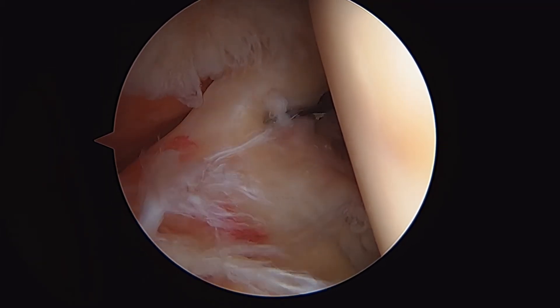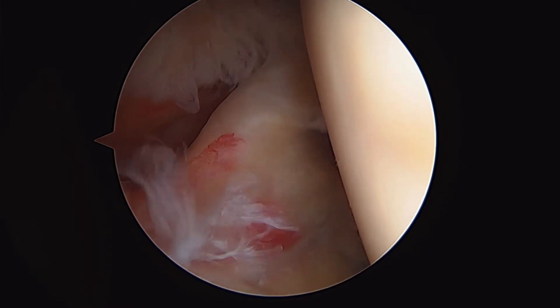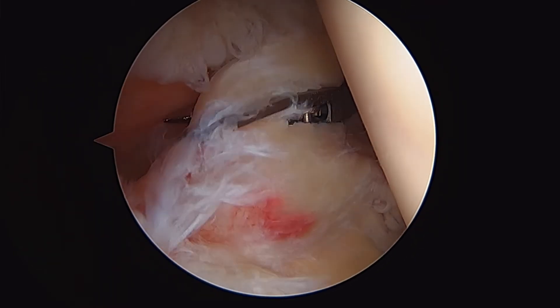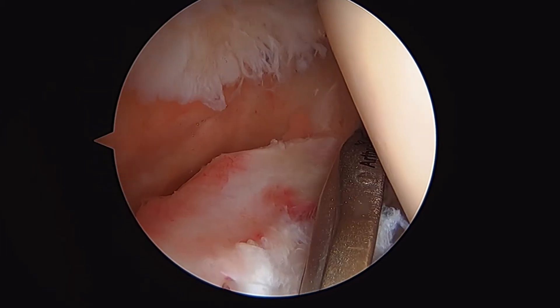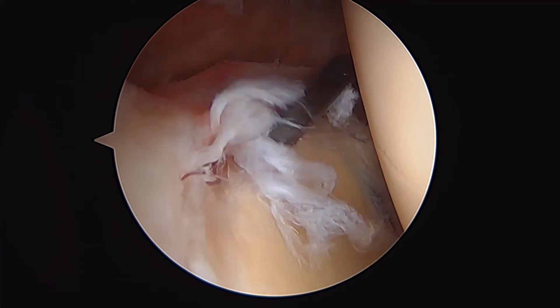The first step in this process is snipping the long-headed biceps tendon. You can see my arthroscopic scissors coming through here, and we're slowly going to cut the long-headed biceps — and there you can see it's released.